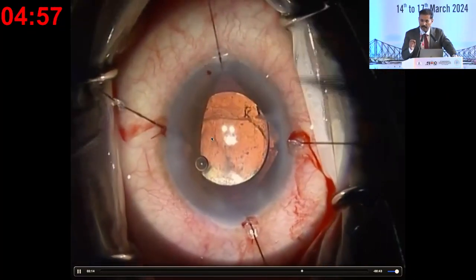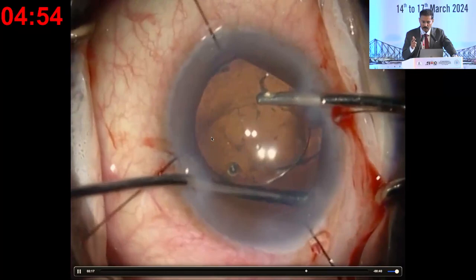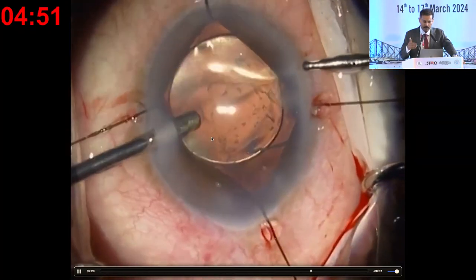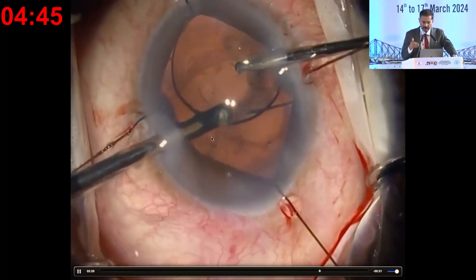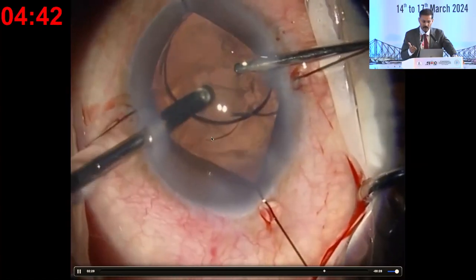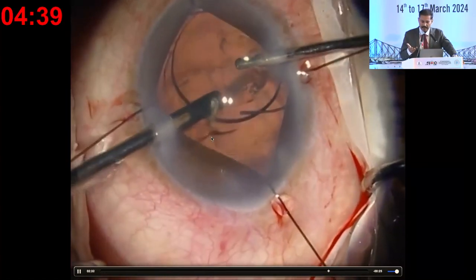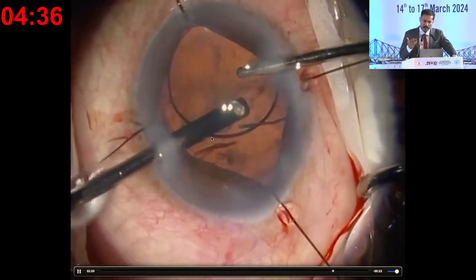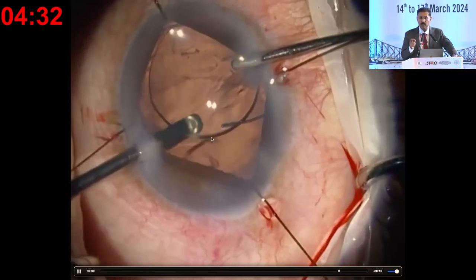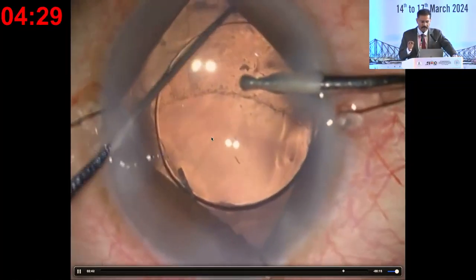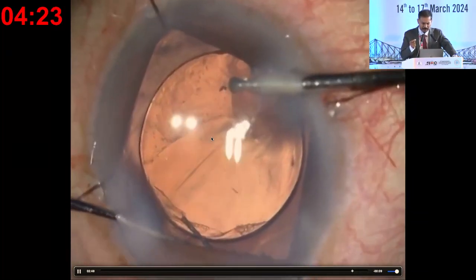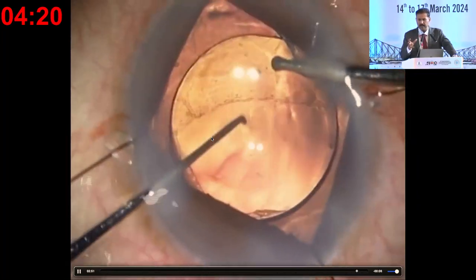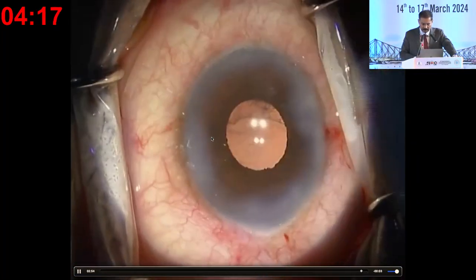Do not take out anything without putting in viscoelastics. I now dilate the pupil. Mostly the pupil will come down when the nucleus is being taken into the anterior chamber. Dilate it, visualize, and do a vitrectomy, because a lot of visco has gone behind into the vitreous and it is difficult to take out without disturbing the vitreous. I do a vitrectomy along with aspiration because HPMC, once it goes into the vitreous and mixes, it causes a lot of glaucoma and inflammation later. The IOL goes into the sulcus and is optic-captured. The good thing is that the IOL is well centered and you won't get PCO later requiring YAG.